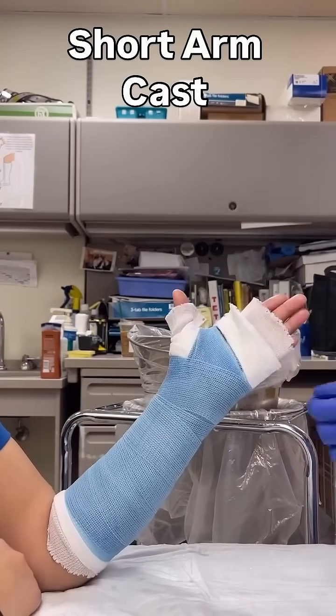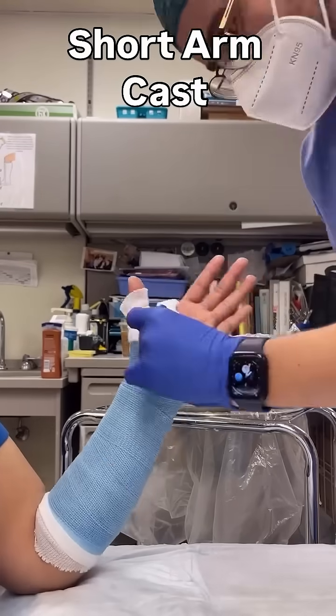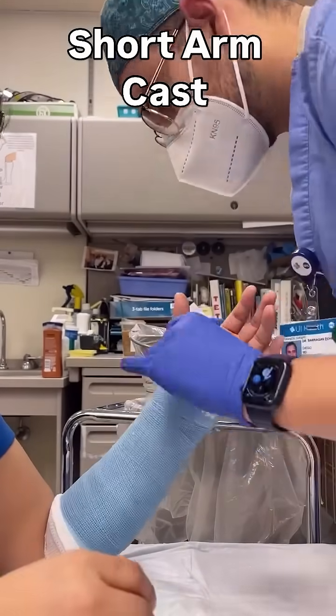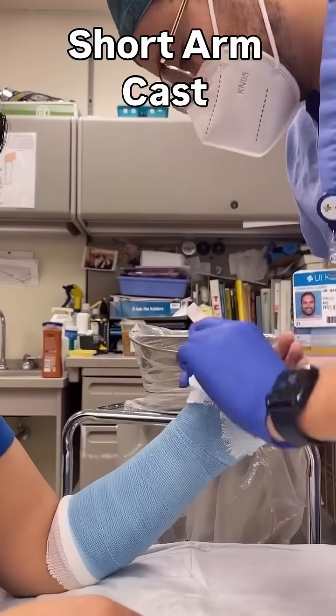Once you're done molding, you will fold over the edges. It's helpful to fluff them out a bit before folding, and if you have too much, cut the sides — that way you'll have an easier time folding the edges.